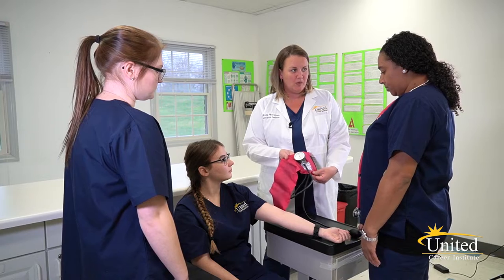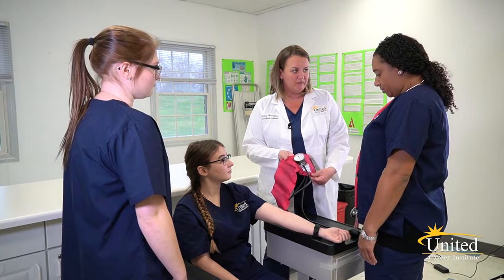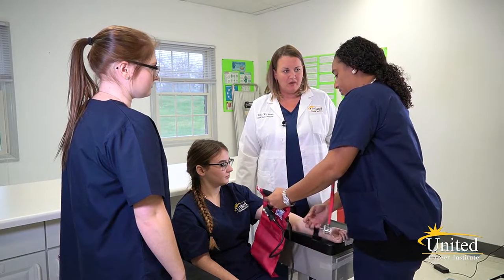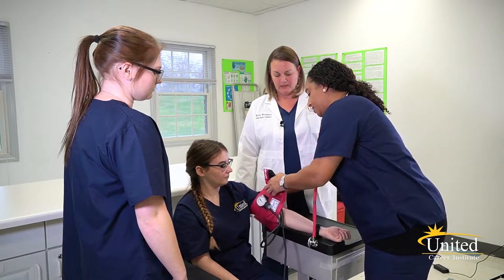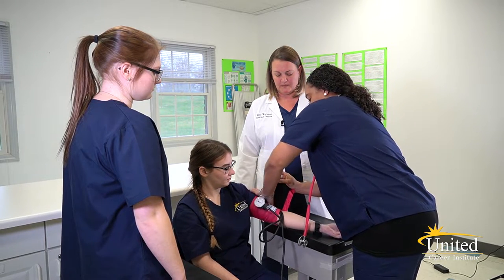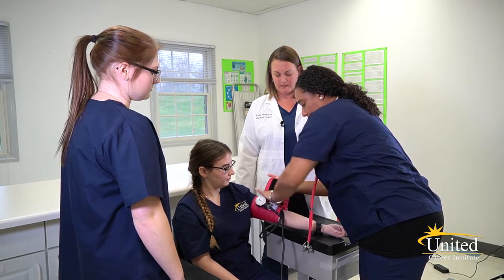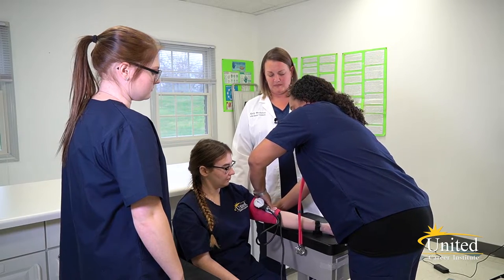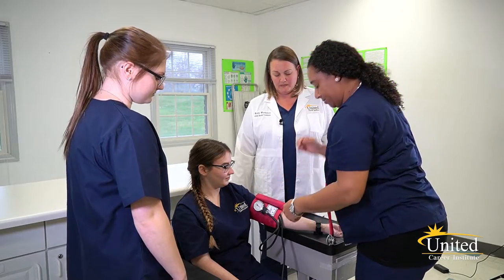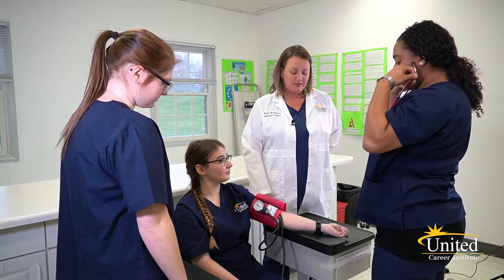When you apply the cuff, you want to make sure that the arrow is corresponding to the artery in the arm. Yes. And how much should your cuff circle the arm? 80 to 100 percent. Yes.